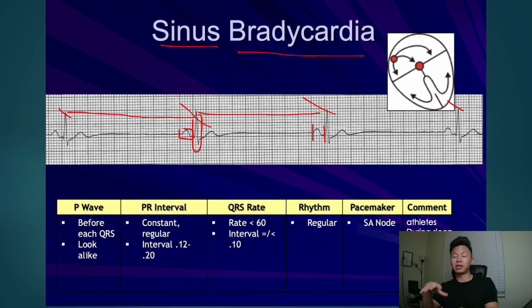And we'll basically, that's a discussion for another time on the pacemaker settings, but we give it a rate, we put a pacemaker, and that is what keeps that heart beating. And only when symptomatic is when we're treating it, okay?